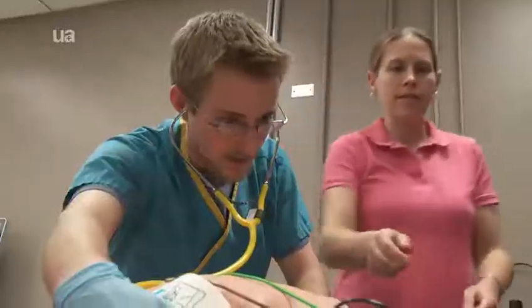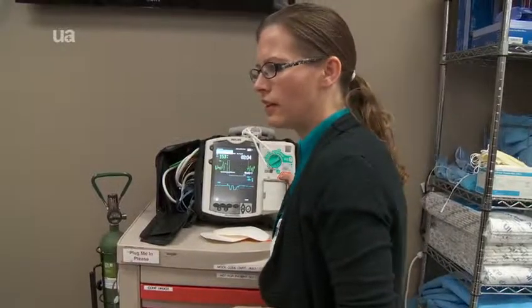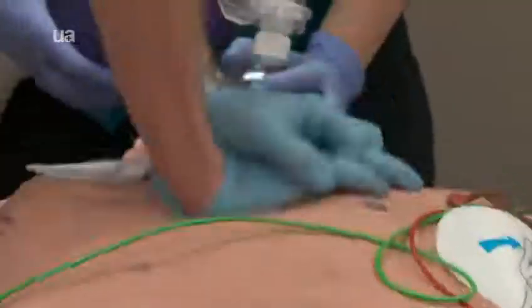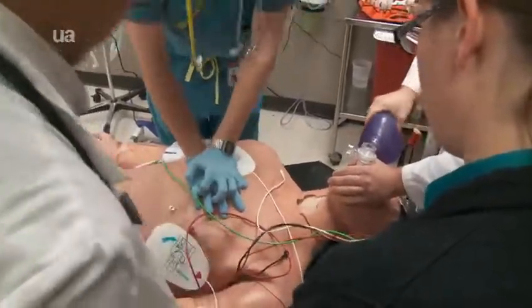Okay, everyone clear? I'm clear, you're clear, we're all clear? Yes. Shock delivered. Resume CPR, bag mask ventilation, please. What I need you to do is hit the start pacing button. Good. Can we get a new blood pressure?